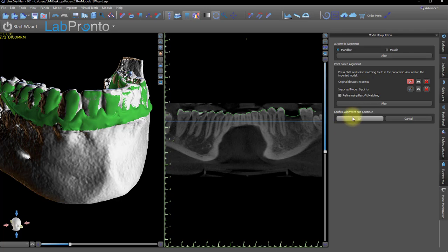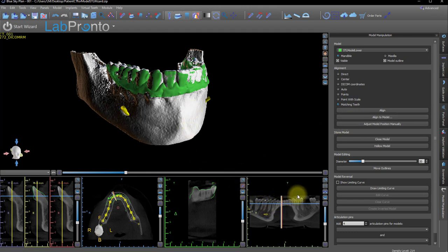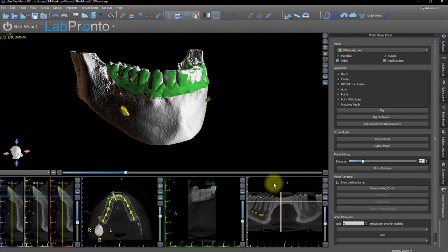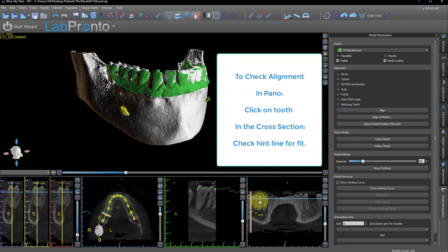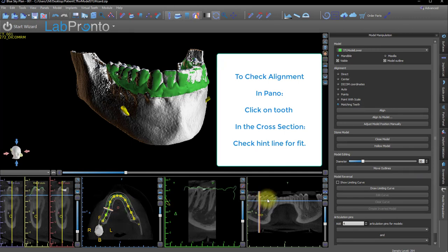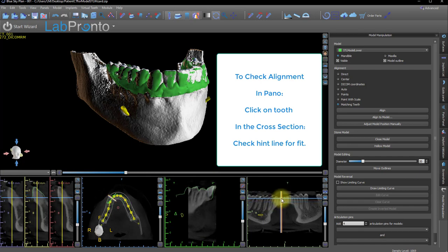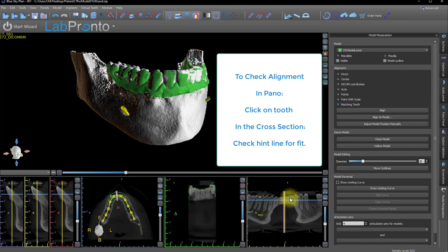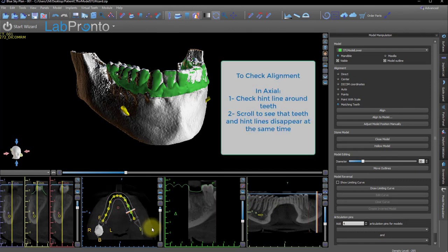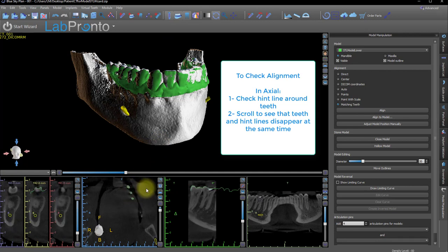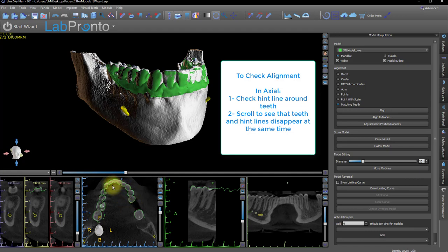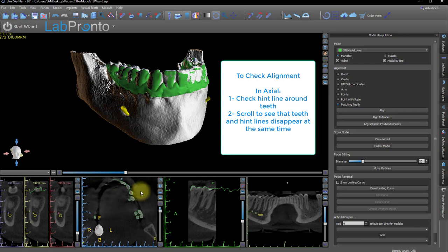Clicking OK will bring us to the other view, and we'll be able to right-drag and push forward to zoom in on the pano. Clicking the pano on each of the teeth and looking at the cross-section hint lines for the model, watching the contour to show that the model and the outline of the teeth are as one. In the axial view, I'll shut off the projections and scroll through the crowns to make sure there's a snug hint line of the model around the teeth, as well as both disappearing at the same time.